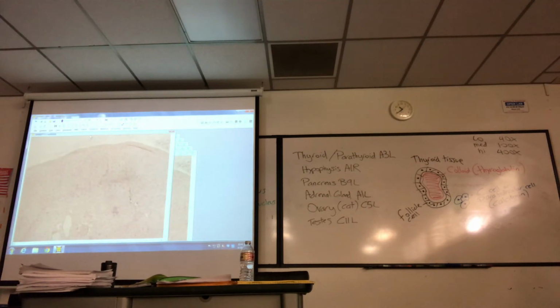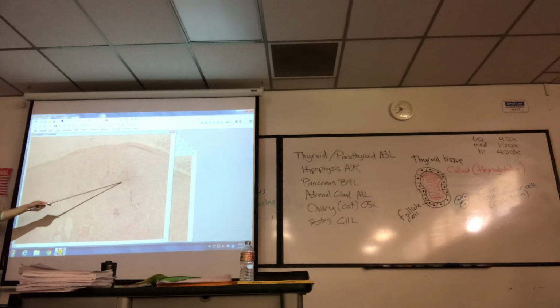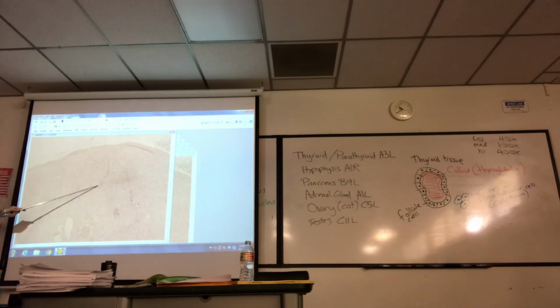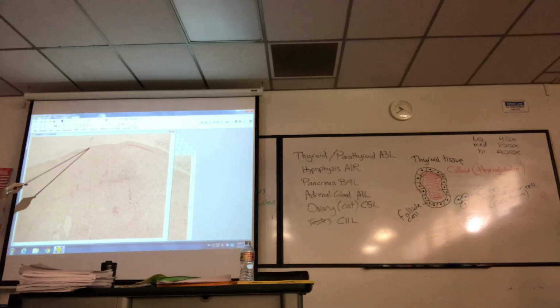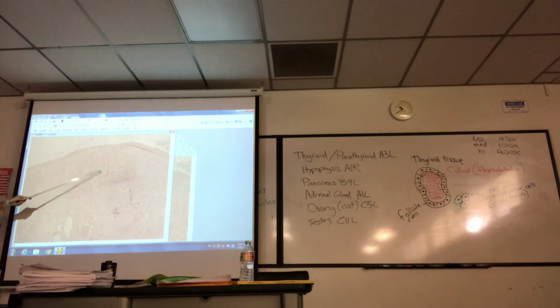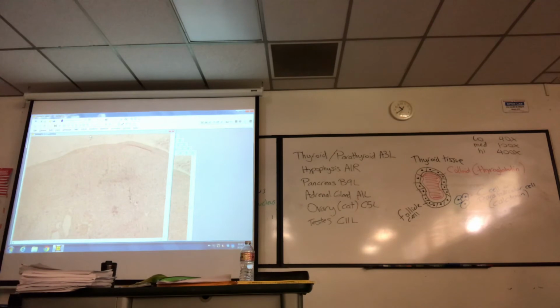Adrenal gland. So I'll point it out to you. Here's what I see. Here's the border between cortex and medulla. So if I point to there and say identify adrenal medulla. This is all cortex. That top thing is the capsule. Okay, so this is the zone. Let's go through the zones: zona glomerulosa, zona fasciculata, zona reticularis. That's it. Moving on.